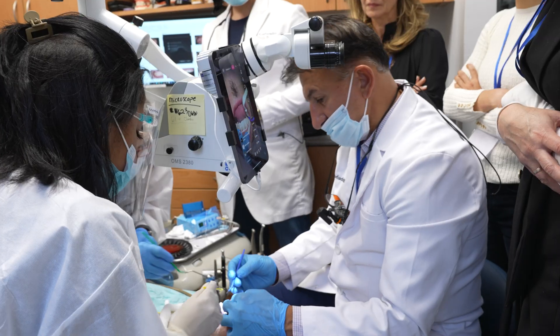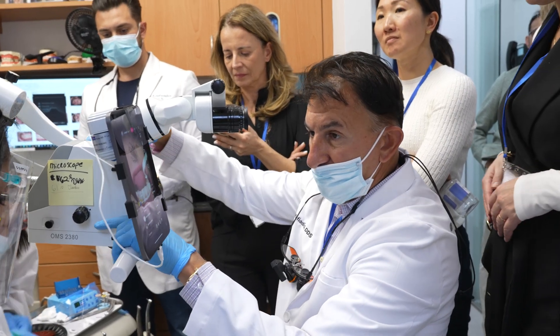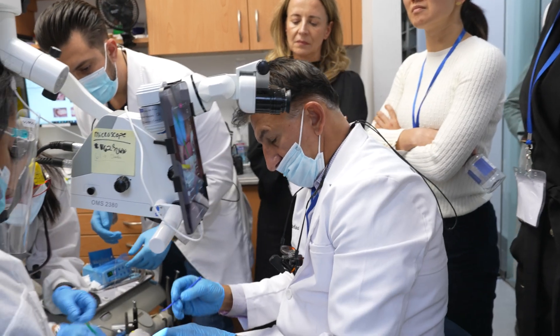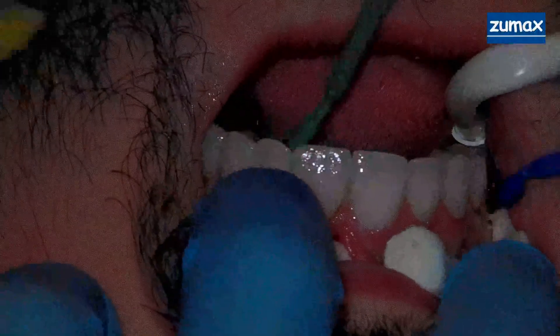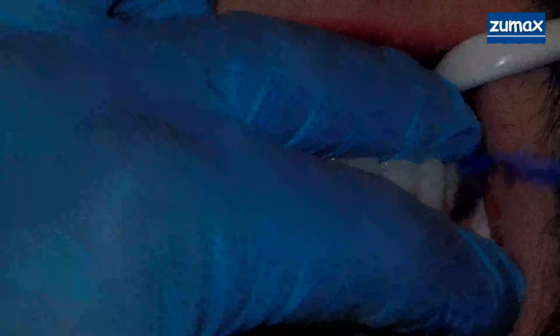And now putting it in. Now we need the doctors to go ahead and clean. I'm going to bring the microscope back from this position and bring it down so you can see better. Everybody's cleaning. So we're going to tack the back for a second because sometimes they move. I don't want to have problems with the back teeth shifting or falling into the mouth.